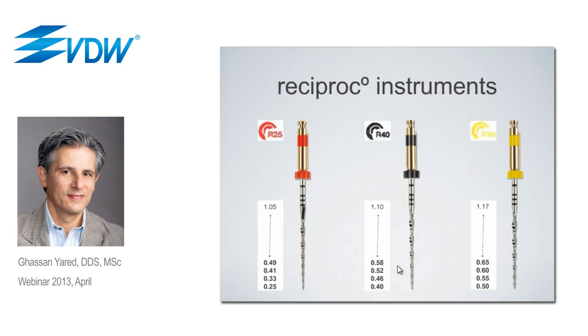Now, the Reciproc system has three instruments. There is the R25, that is the main instrument. The R25 has a diameter of 0.25 millimeter at the tip. Then it has an 8% taper over 3 millimeters, and then there is a regressive taper, so the taper after 3 millimeters decreases.